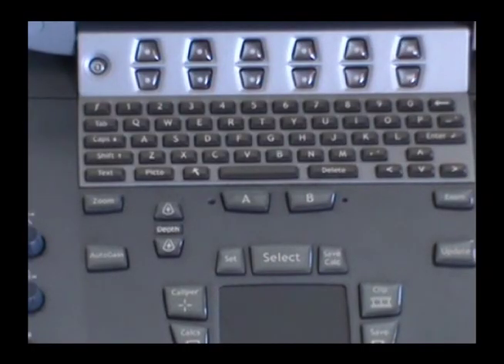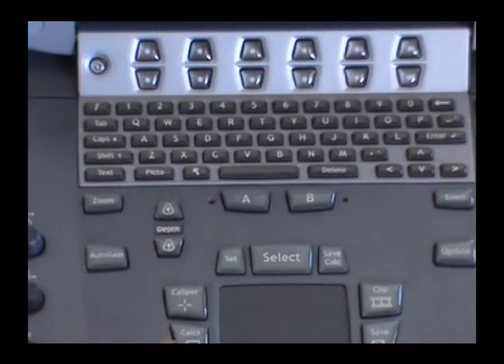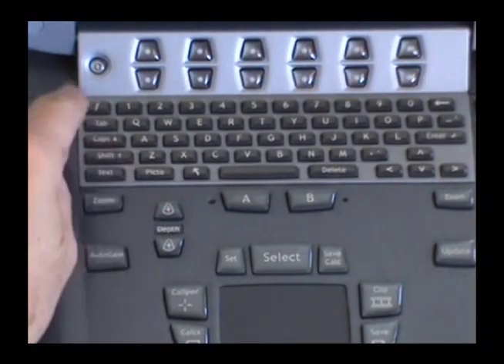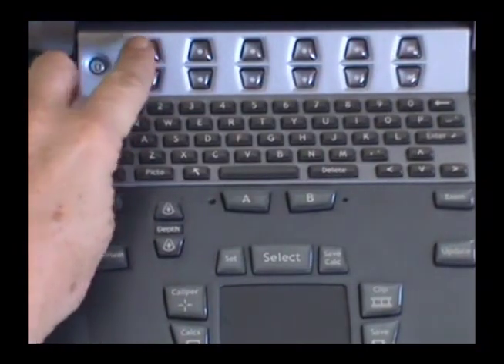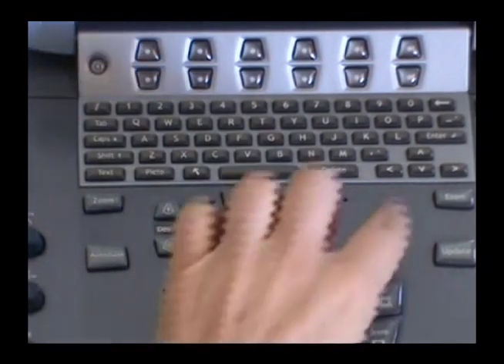Adjust depth to fill the ultrasound screen with the organ of interest. If needed, adjust transducer frequency for the current depth. Adjust gain for the best image. And adjust focal points to the bottom of the organ of interest.